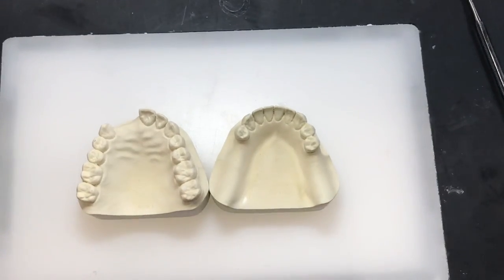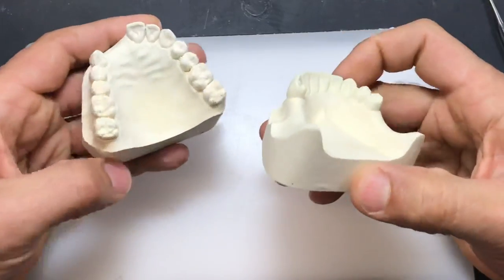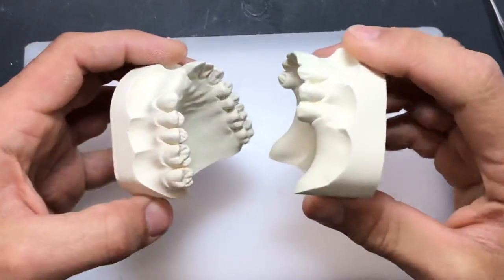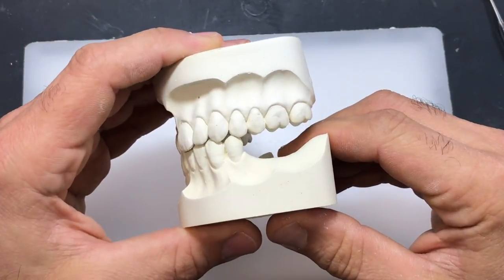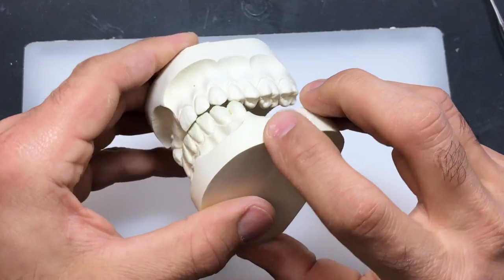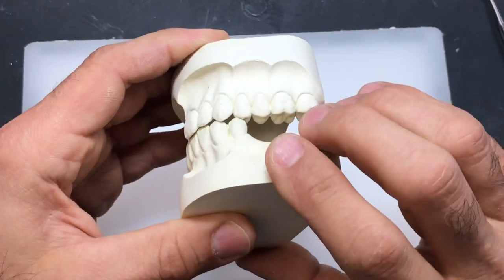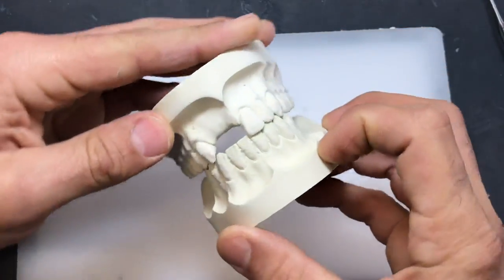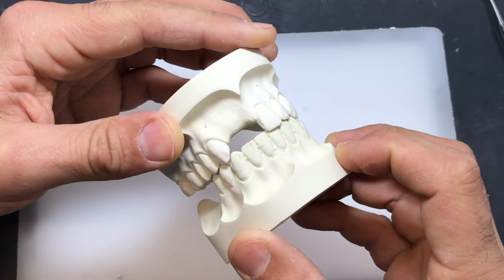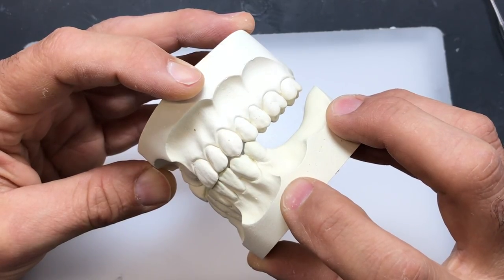For this scenario where we need to fabricate a maxillary and mandibular acrylic partial, we need to mount this case in centric occlusion because there are natural teeth opposing each other. I have a pretty good sense of how things come together, but I'm not really sure. As it feels in my hands, this case could rotate. You have to be absolutely sure how these come together in centric occlusion, otherwise you're going to have a huge occlusal error by the time you finish the case.